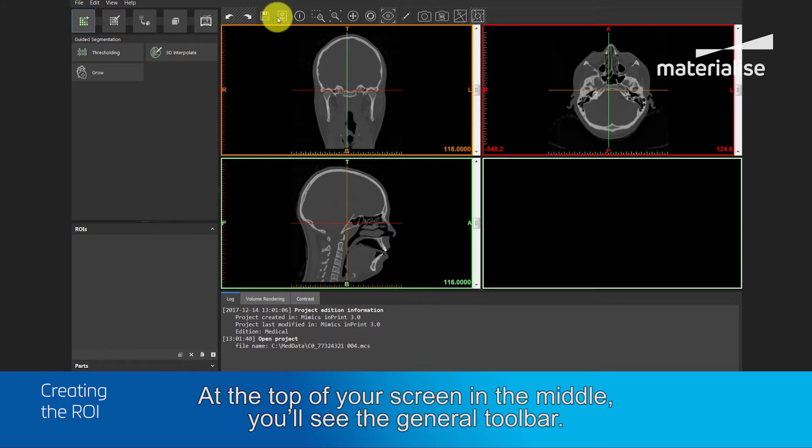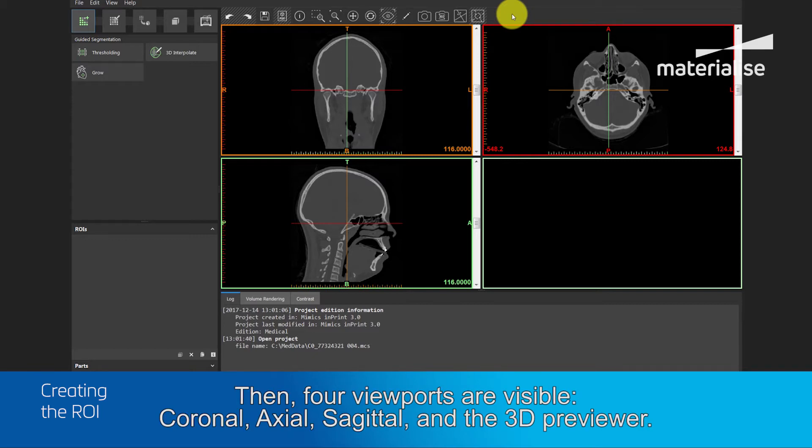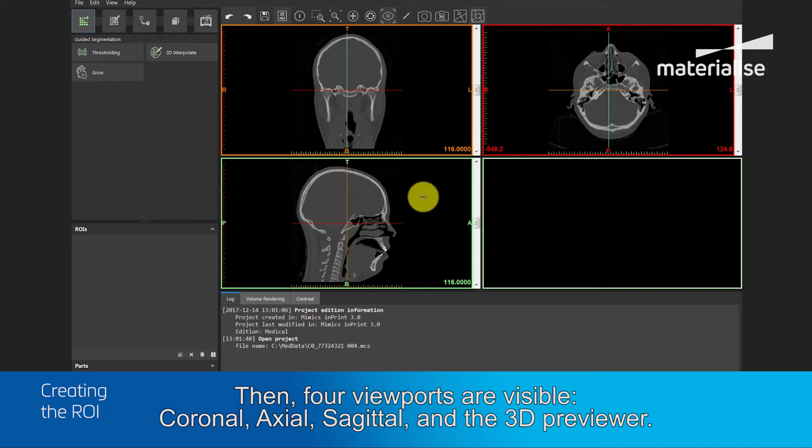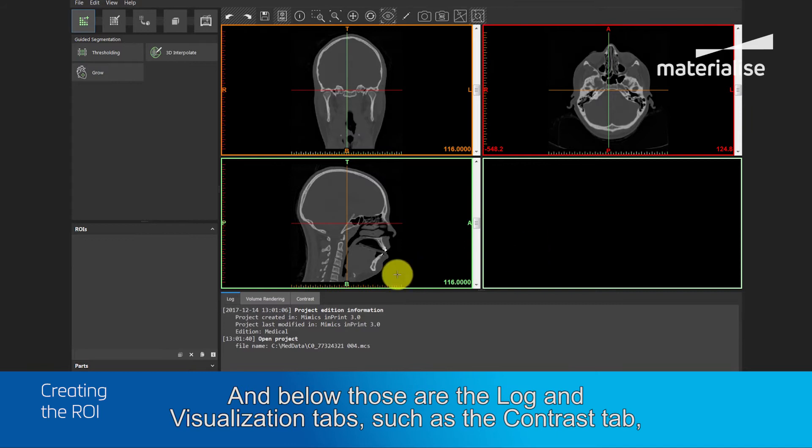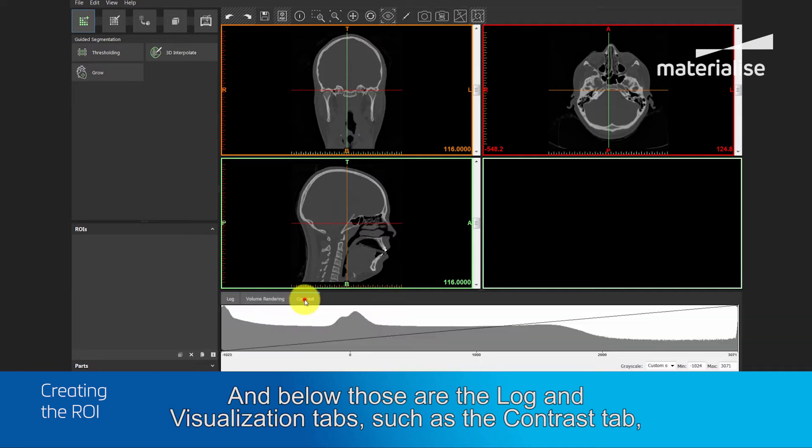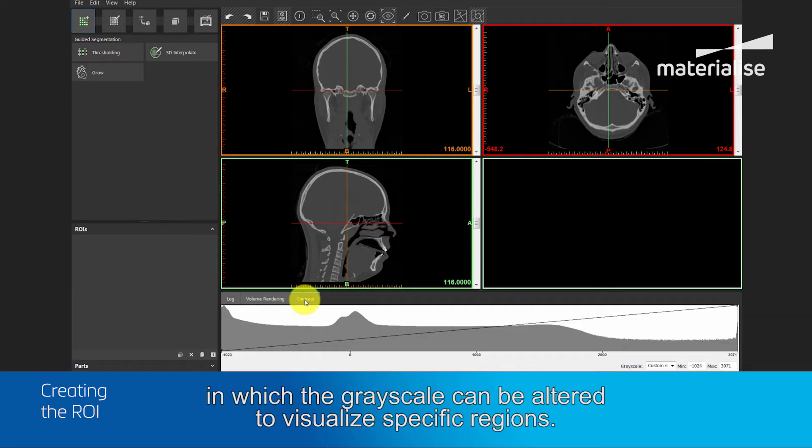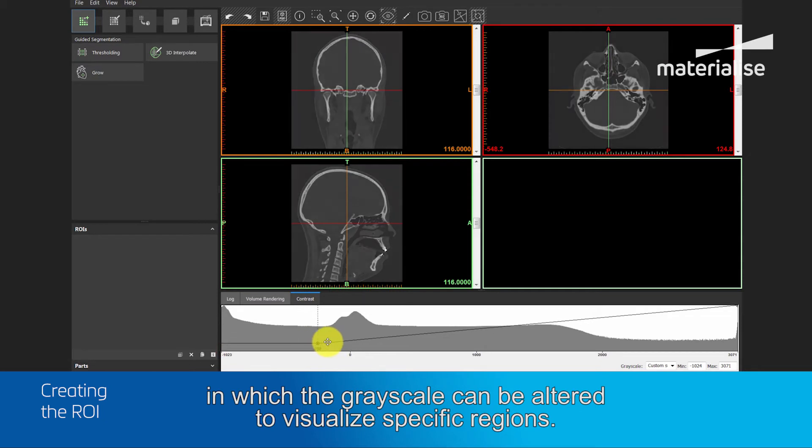At the top of the screen, in the middle, you will see the General Toolbar. Then, four viewports are visible: the Coronal, Axial, Sagittal and the 3D Previewer. Below those are the Log and Visualization tabs, such as the Contrast tab, in which the grayscale can be altered to visualize specific regions.